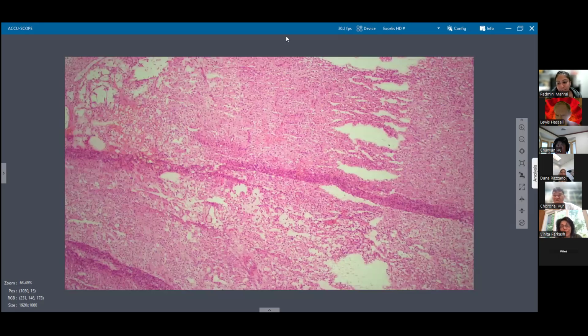So it's an interesting case. I asked her, because when I first looked at it, my thought was, okay, it could be steroid cell just because it's very orange. But I even discussed that this could just be a corpus luteum cyst. And I asked her if she wanted a frozen, and she did. And so then this was a nice little finding. We'll see what I end up getting for the permanent. But it's a great point. I don't see any pigment in this section. Well, it's a cool case. I'll have them put the whole thing through since it's not so big.